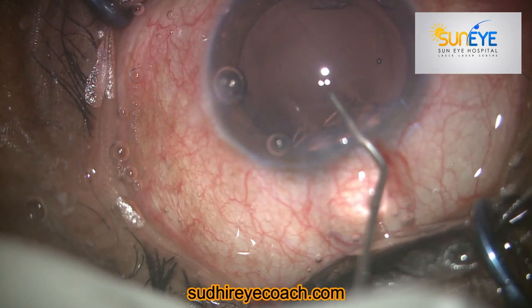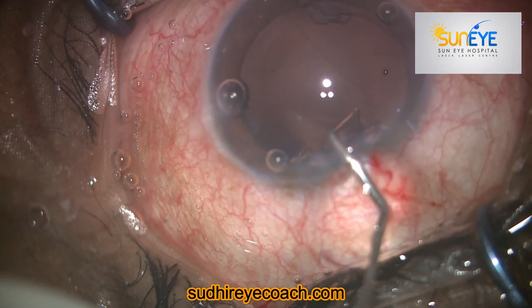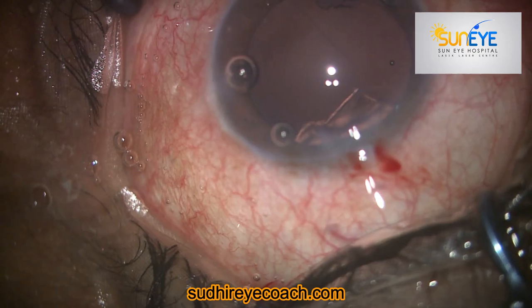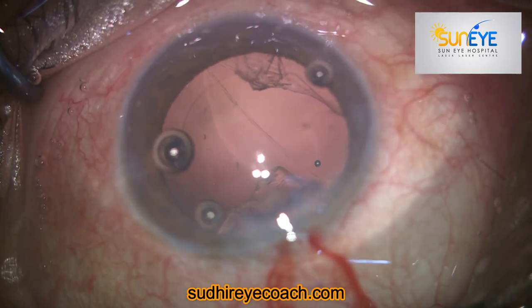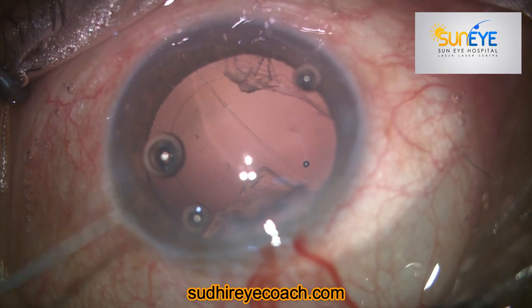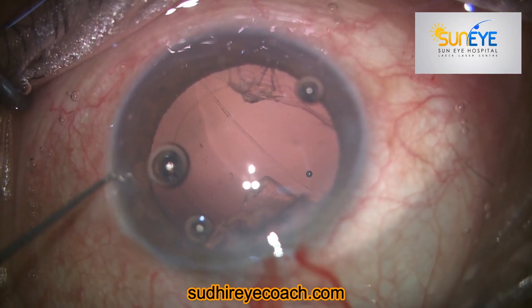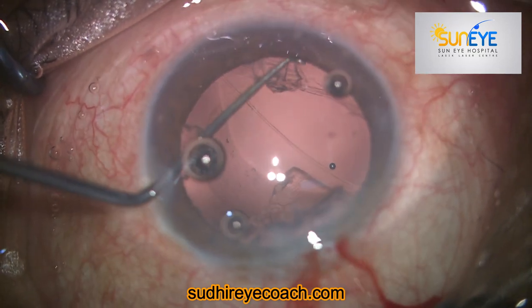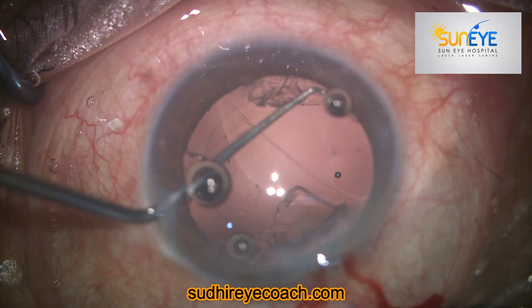Luckily in this case the vitreous face was intact, so I was able to aspirate a decent amount of cortical matter without creating much extension of the posterior capsular tear and without any dislodgement of the vitreous.